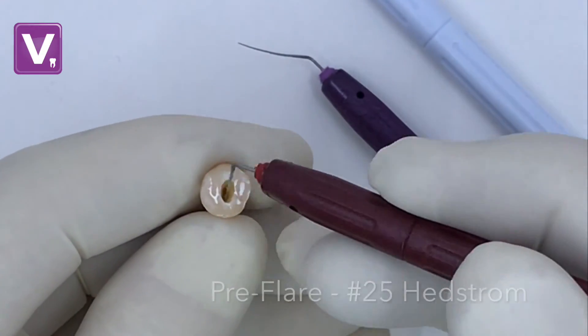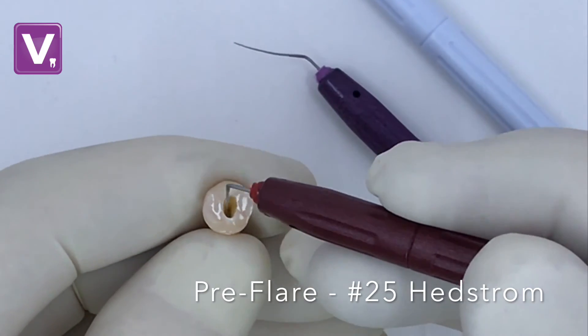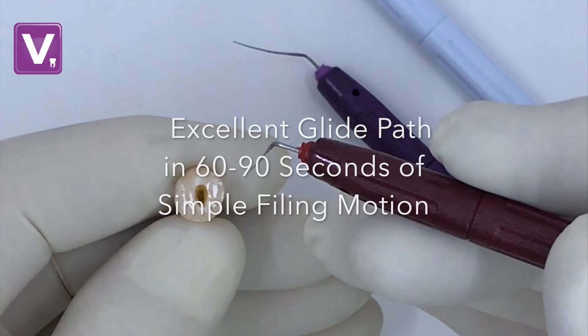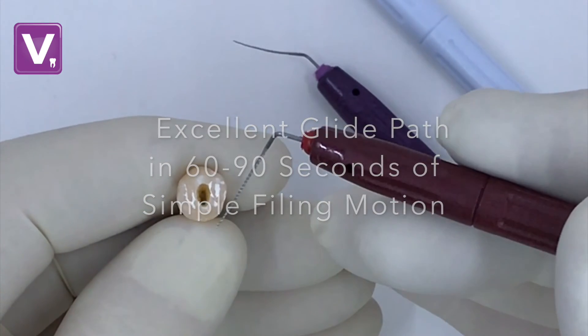Next Step: Pre-Flaring. The aggressive flute design of the number 25 Hedstrom file is even more efficient when used in the endo handle. This proven sequence is a quick and easy way to prepare an excellent glide path for all other shaping files to safely follow.